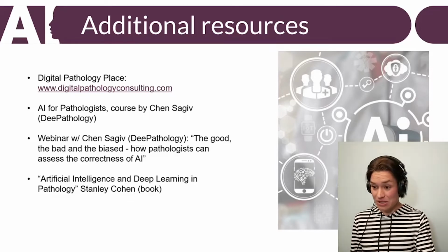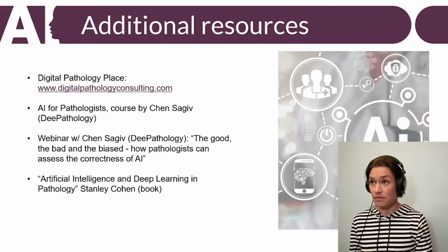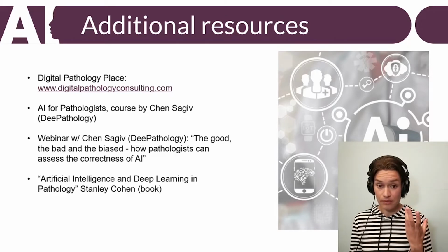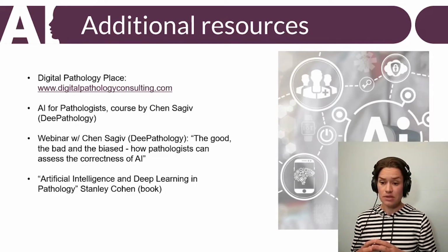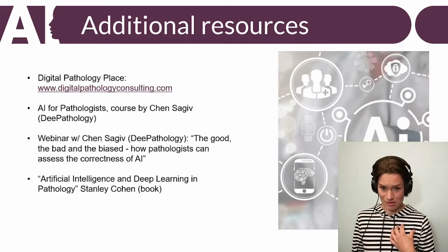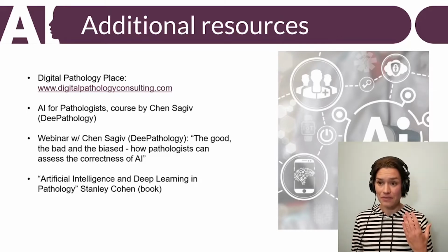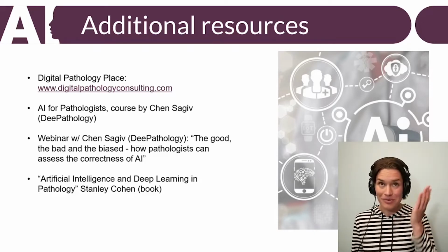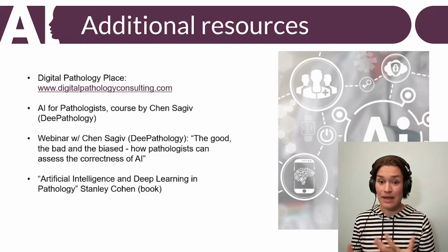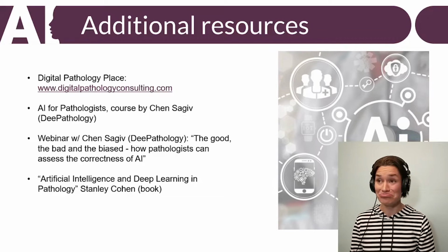I have another question in the chat. How can one use AI effectively? The use of AI is driven by what you want to do with it. So you identify your problem, and then you identify a tool. How do you evaluate this tool? First, something that is important for me: do I like working with this tool? There's always a learning curve. How steep of a learning curve am I willing to hike to be able to fully utilize this tool? Given a pathologist's workload, I would not want it to be too steep. I would want it to be pathologist friendly.